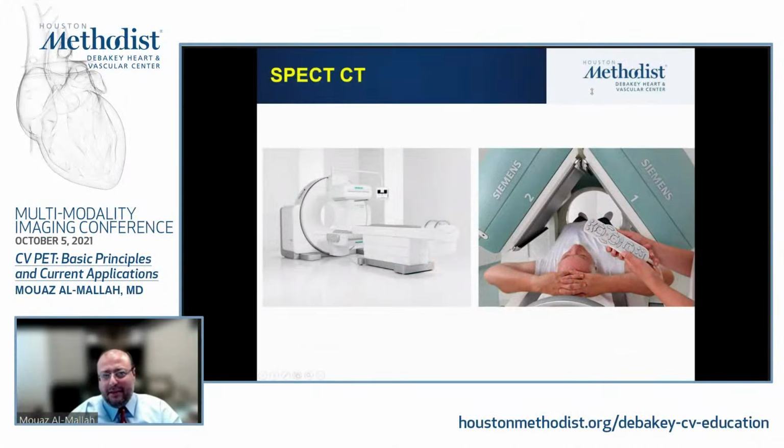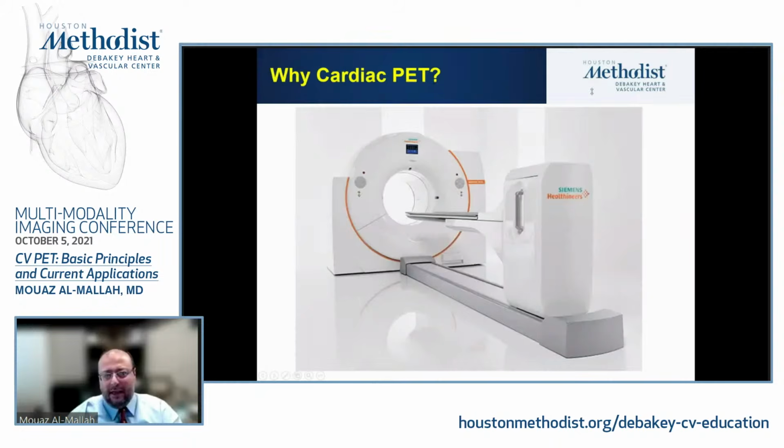However, in PET imaging, and this is the machine that we have in our lab and our research institute, it is a PET CT. So in the front we have the CT machine. On the back we have the PET machine, and it is a hybrid system that allows us to acquire these images. And behind these covers, this is one vendor's PET CT. This is another vendor, and the same concept: the table, you have the gantry, the PET system.